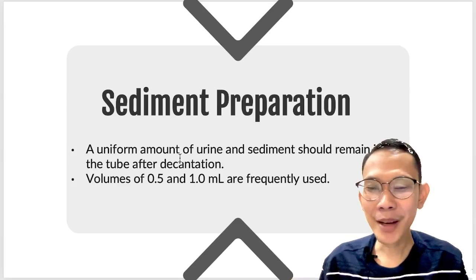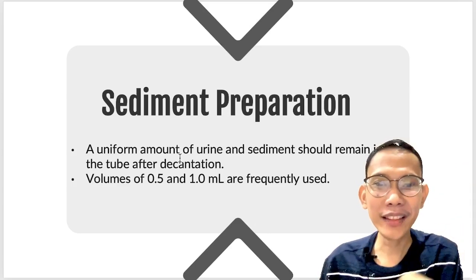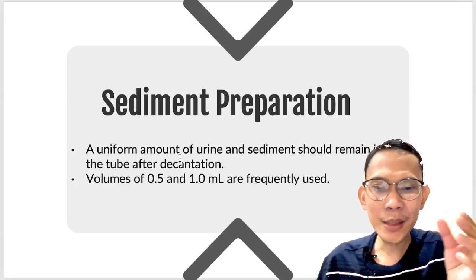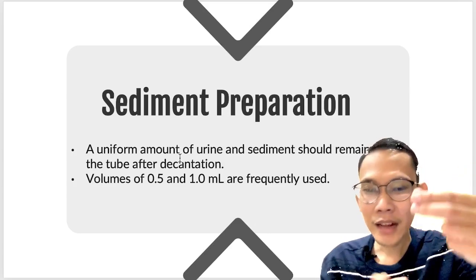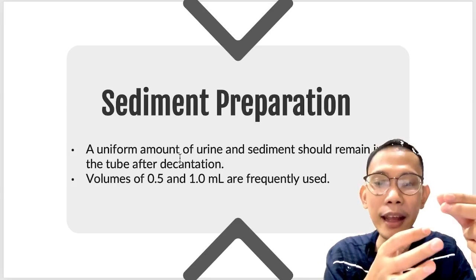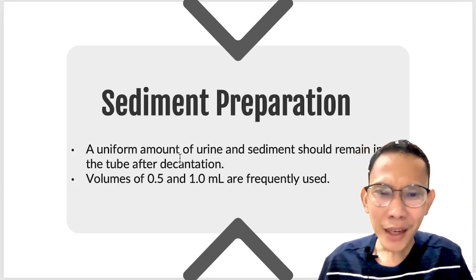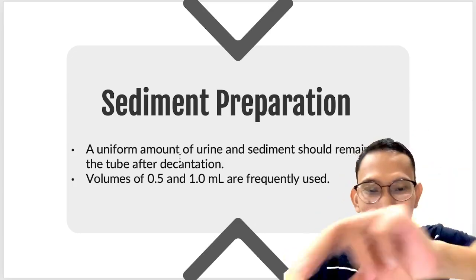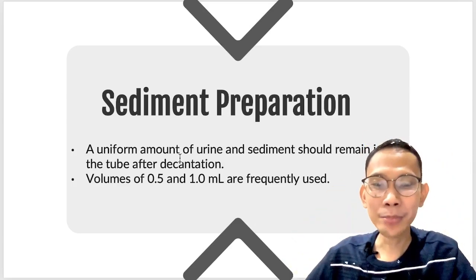Usually, anong nangyayari sa mga student when we ask na, sige, after centrifugation, na-centrifuge na natin yung ating urine sample, tapos sige, you decant it. So, pag i-decant lang, simple lang, itatapon lang natin sa sink, and then, ang natitira, that's the part na ating babasahin. So, i-flicker natin yung natitira, and then you mix or resuspend, ilalagay natin sa glass slide. Pero, ang nangyayari sa mga student, natatakot sila. Okay? When they decant or tinatapon nila urine, pagtapon nila, agad-agad binabalik nila kasi akala nila wala nang matitira.